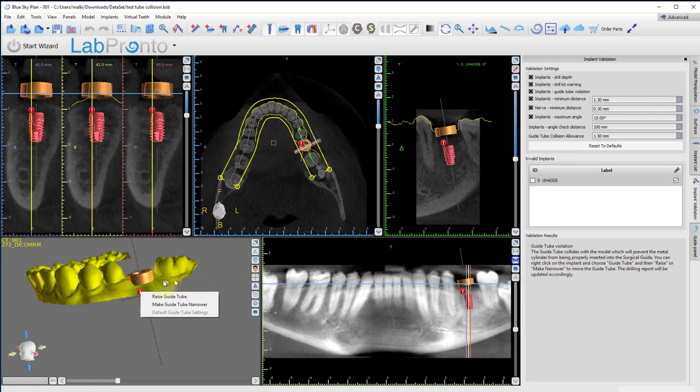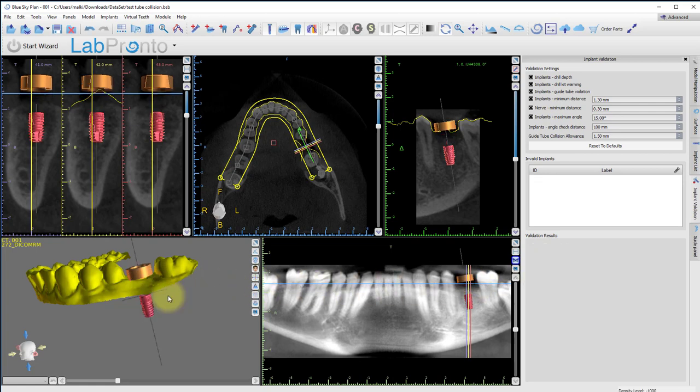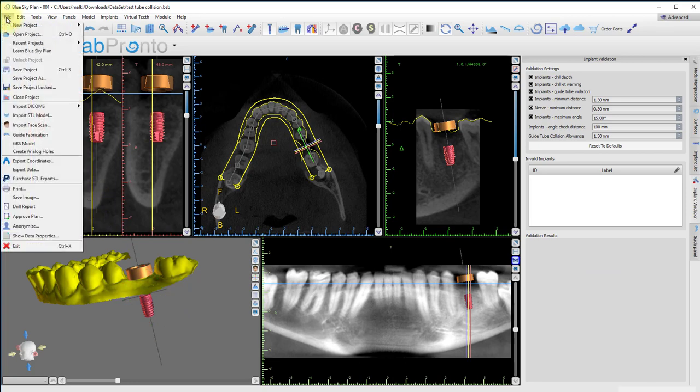We will click on Raise Guide Tube. This resolves the collision and we will be able to check the drill report by clicking on the File menu.